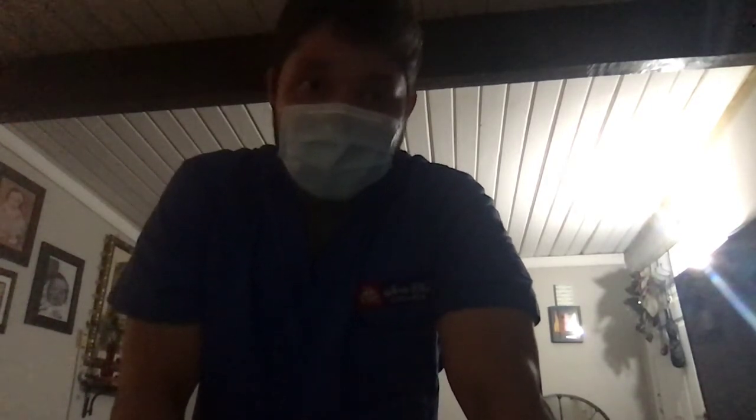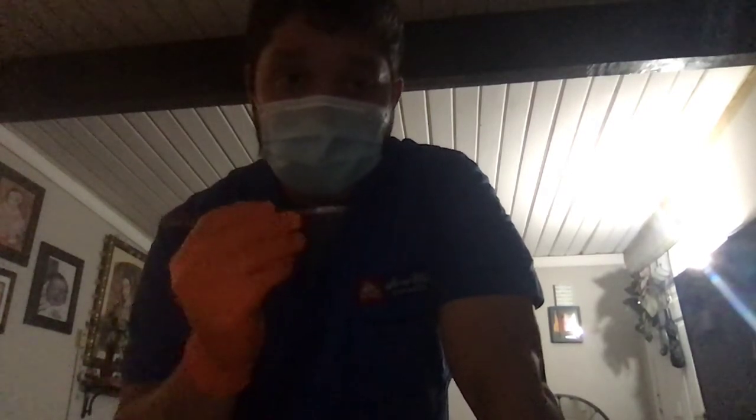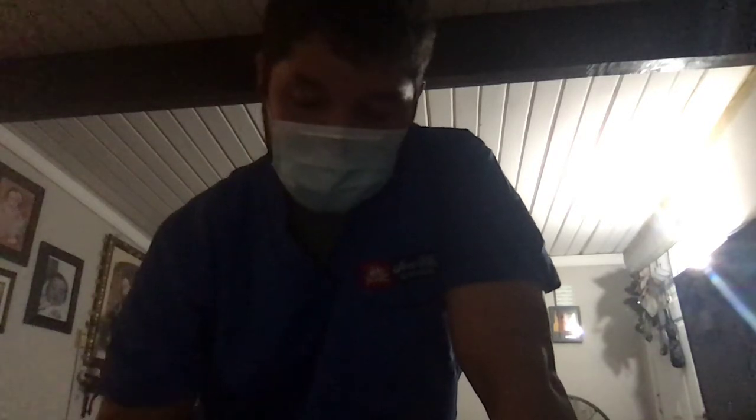I'm going to start out with the intradermal injection, and I'm going to need a syringe, a 27 gauge by 1/2 inch needle, a cotton ball, and an alcohol wipe. I've already washed my hands, gloved up, and I have my face mask on. I've also verified with the physician the proper dosage and medication that will be needed.